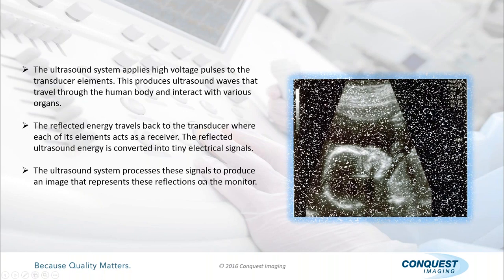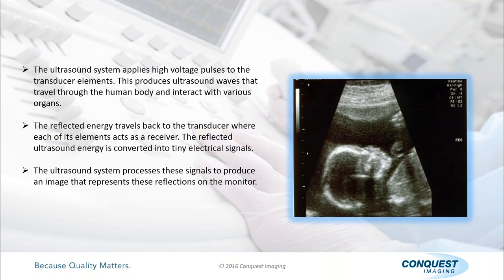And again, just as we're talking about densities of material, I bring up this image, and we clearly have the dark spot just above the baby's forehead. That would be your amniotic fluid. Then we have kind of a lighter, almost white structure towards the top of the image, that would be your abdominal muscles. And then clearly we have the white in the baby's skull, and you can see the jaw, which is very dense material in a baby.